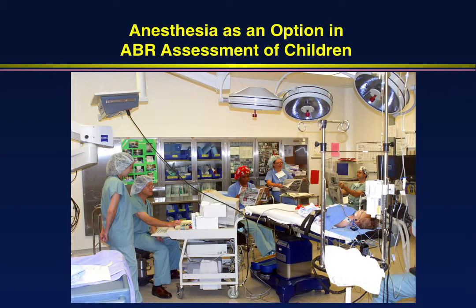I like doing ABRs in the OR because I know the child's going to fall asleep, and I know I can be very quick because they're very quiet. There's no movement whatsoever, but there are many, many disadvantages of doing this.